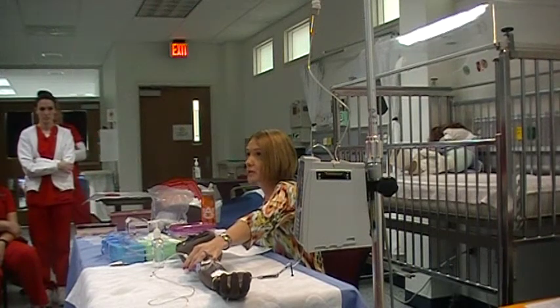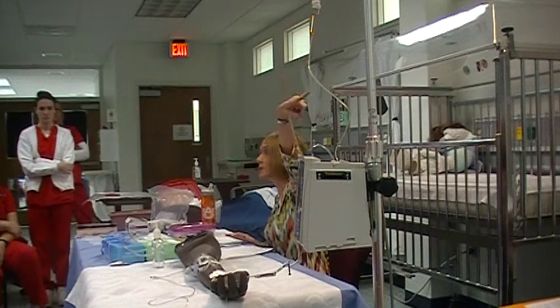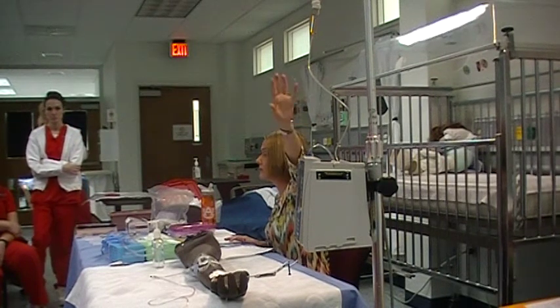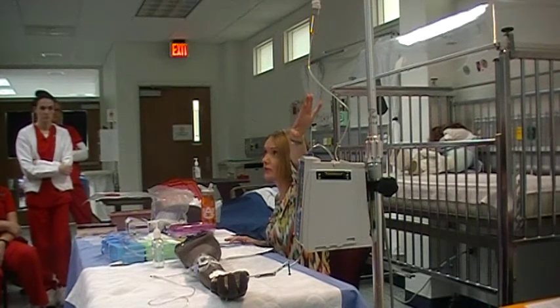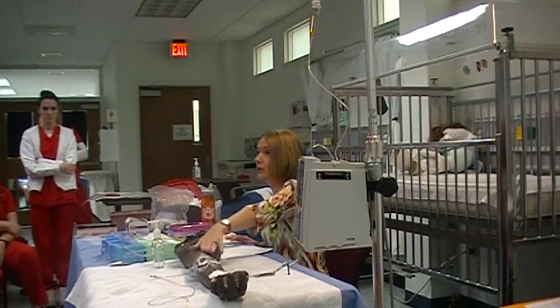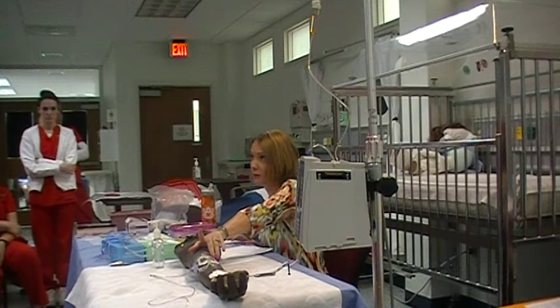And that's when you would stop and look and say, okay, and I may have LR up there. I just put a little tab that said LR. I may have normal saline. It could be anything, and I'll just put a little sticker that'll let you know what kind of fluid you have running for your patient. And that way you can confirm whether or not that medication is compatible with what you have hanging.